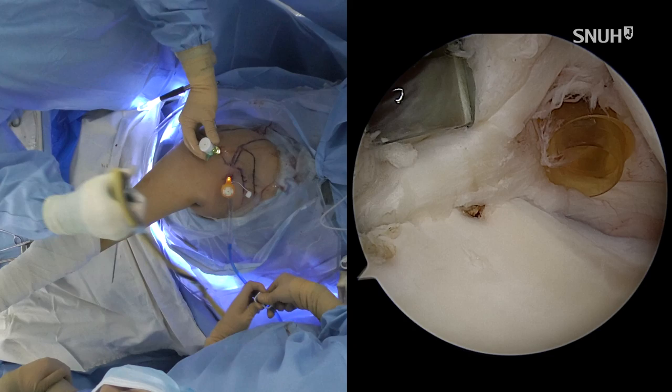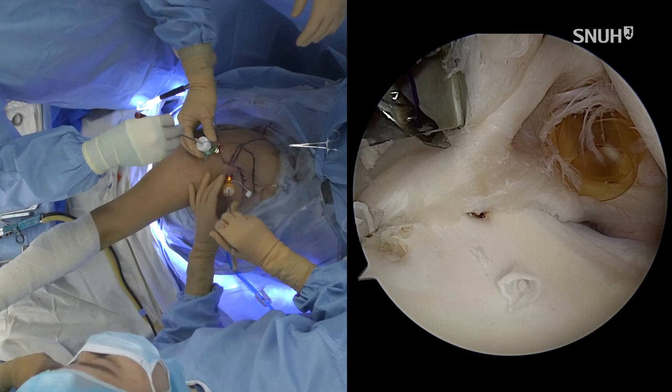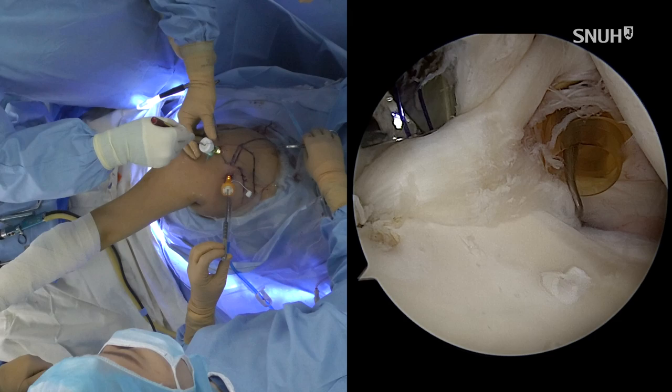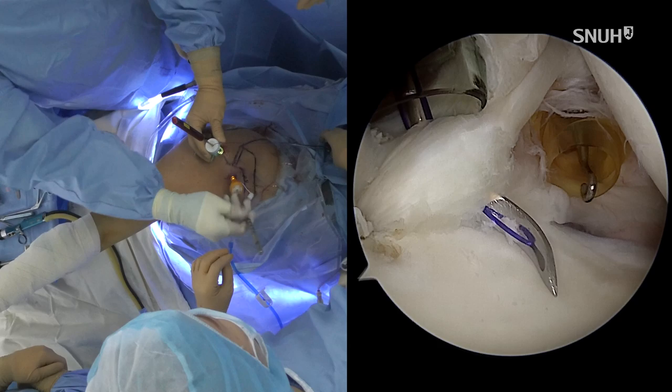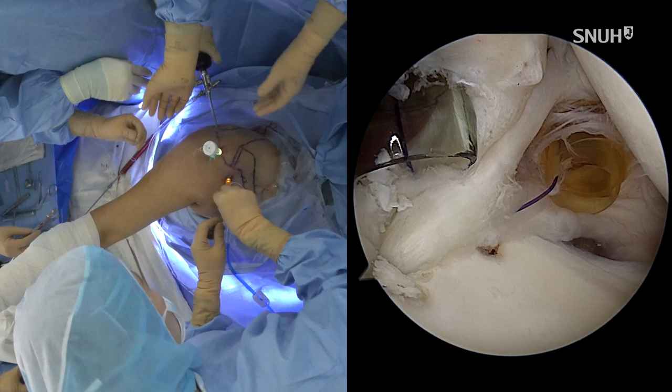One more PDS through the anterior SLAP. Try not to capture the capsule, but only go through the labrum. Then retrieve one limb through the anterior cannula. Then transfer the FiberWire.